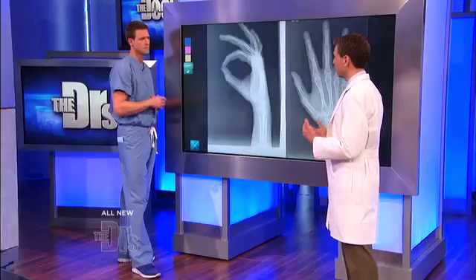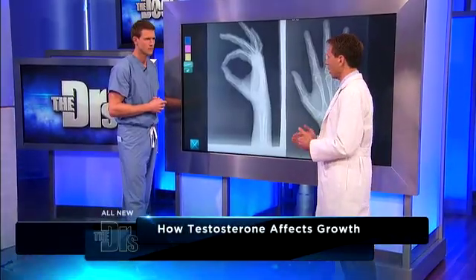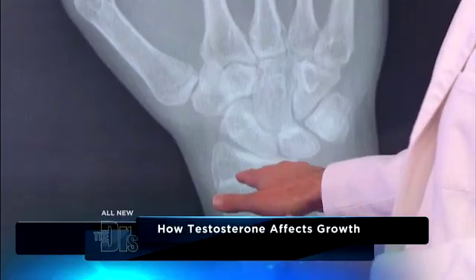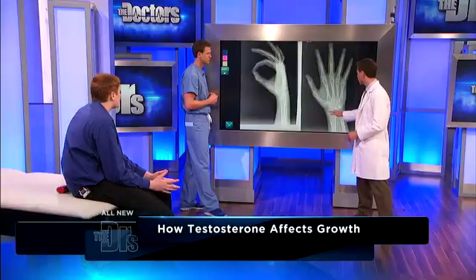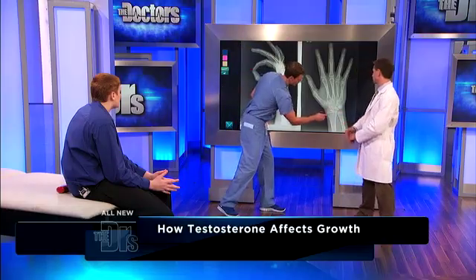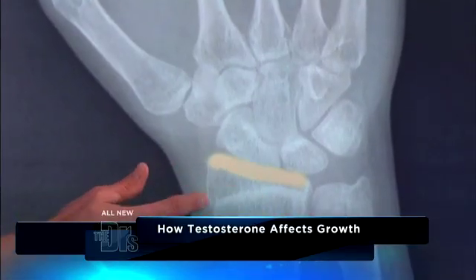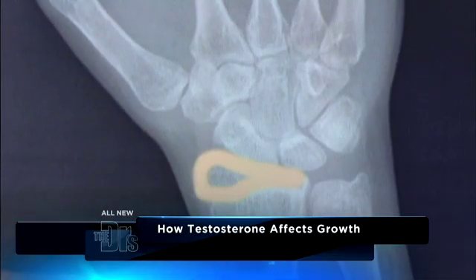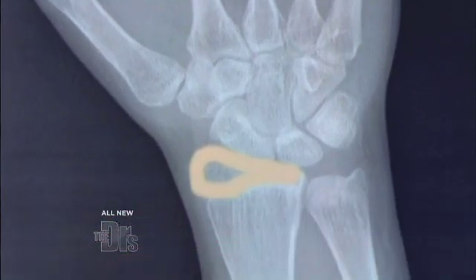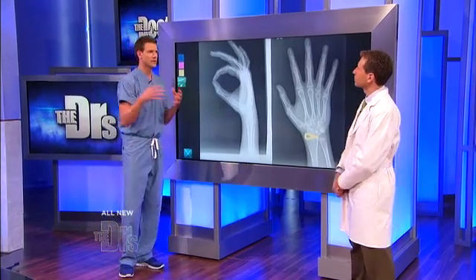Testosterone helps us mature, but it doesn't help us get taller — in fact, it stops the growth of the bones by closing the growth plates. But in Brandon's case, because his testosterone is so very low, these growth plates never closed. Everyone, look at this right here — you see where the bone is a little bit lighter through here? That is an open growth plate. The bone should look like the rest of the bone, that darker white. He never had the signal from the testosterone to close it down.